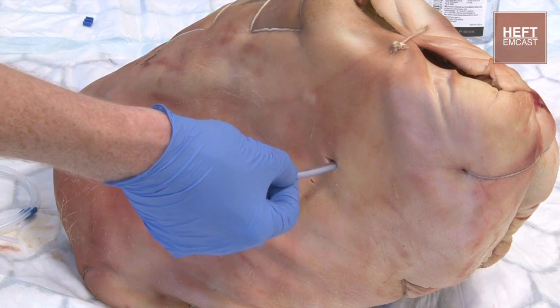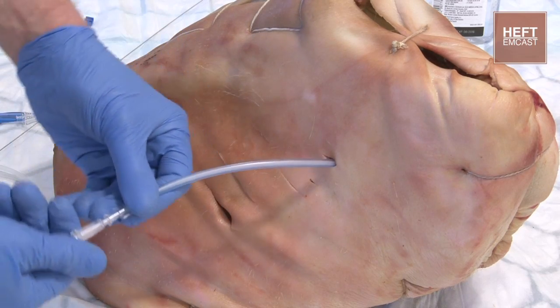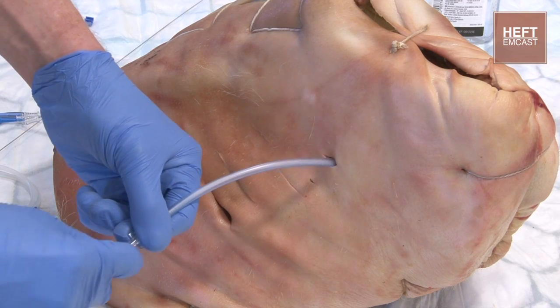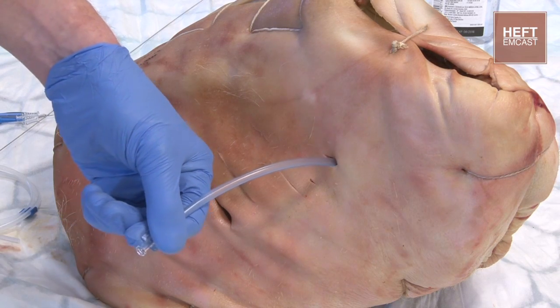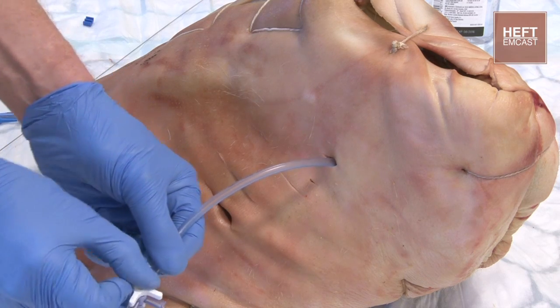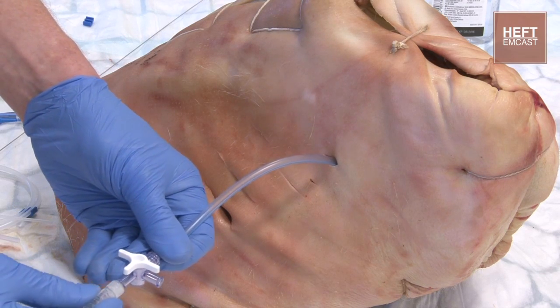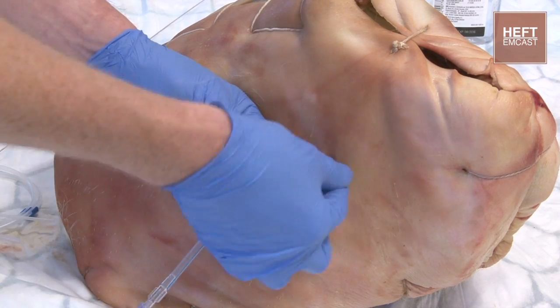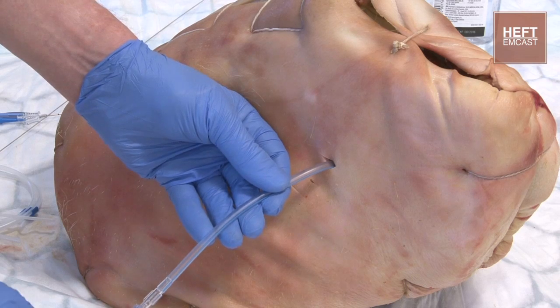Then take the guide wire out. You can then unscrew the stylet from the drain, taking that out — being aware you may have fluid that comes down the tube when you do that. Attach your three-way tap, closing the drain off for the moment. Screw that on. Attach your drain connector, which goes off onto the drain tube. Then just suture that in place, and check you're in the right position with your x-ray and your clinical examination.